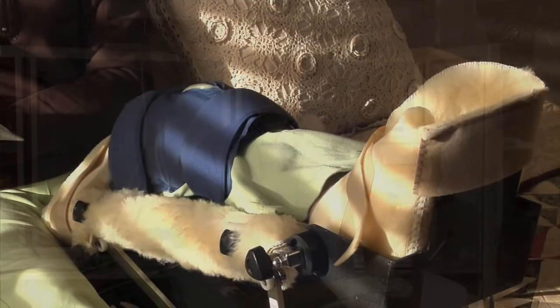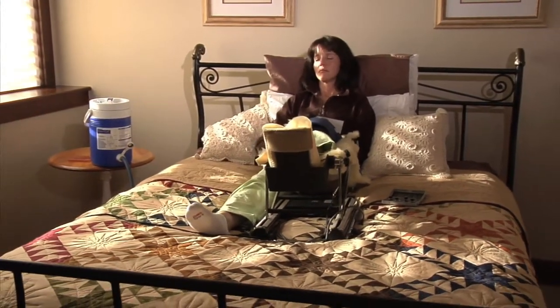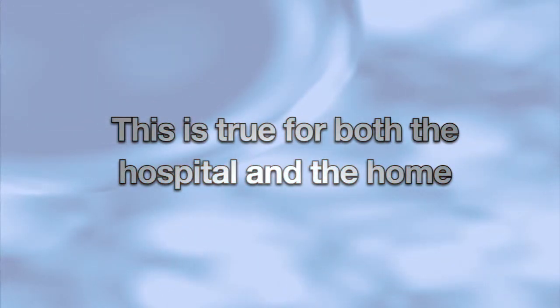Over the past 20 years, the Medcom Group has developed several pearls in order for patients and clinicians to get the maximum benefit from CPM therapy. We'd like to share them with you. We have found that patients who use the CPM machine at night while sleeping wake up with greater mobility and have a more restful night. This is true both in the hospital as well as in the home. So keep in mind that flexion may be reduced at night to assist with restful sleep.